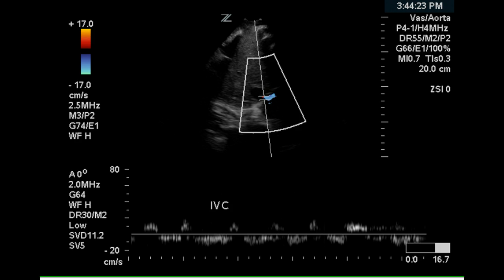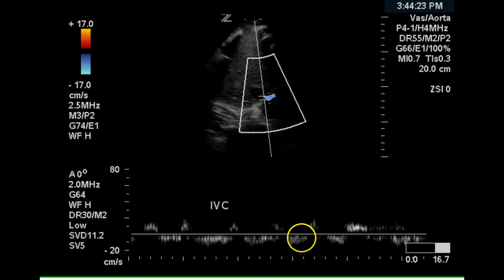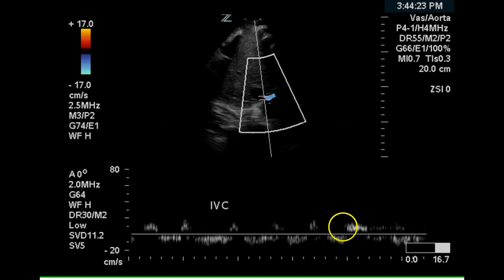The inferior vena cava also has a mild atrial kick, and here it appears to be phasic with some inhalation by the patient. This is normal for the vena cava.